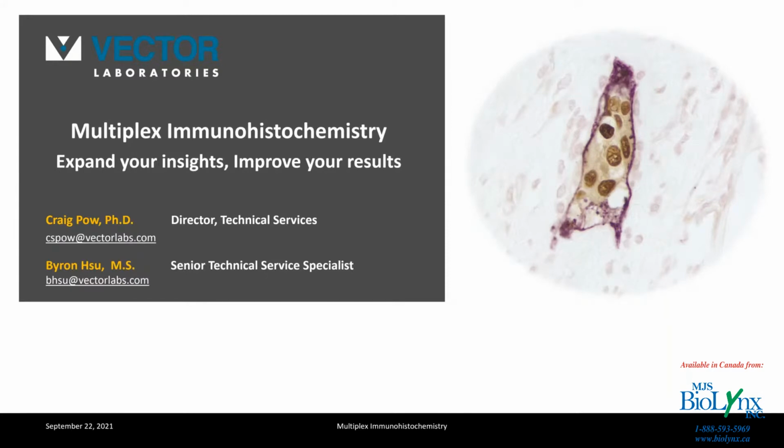These methodologies are gaining importance as researchers investigate spatial relationships, intracellular signaling, or the tumor microenvironment. Today, we're using the term multiplex to highlight multiple antigen labeling on the same tissue section using enzyme-based systems.